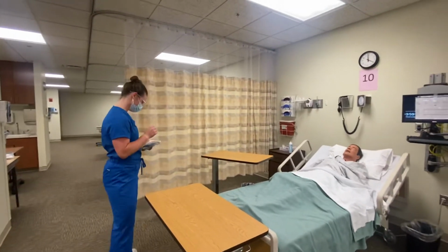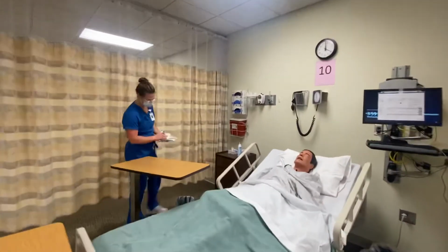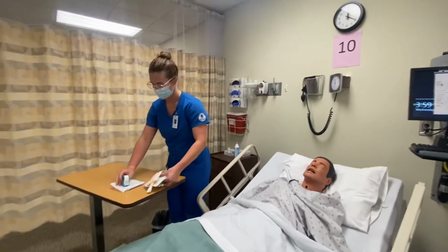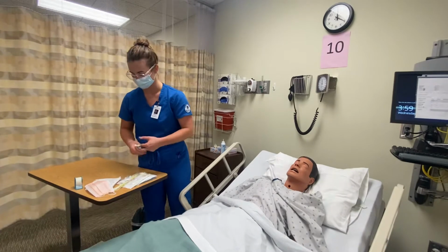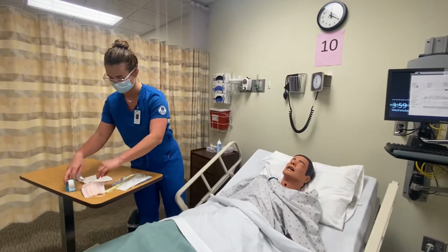Come in. Hi. Hi. My name's Liz. I'm going to be your nurse today. Hi. Just going to set some stuff up here. We're going to be doing a central line dressing change for you today, okay? Okay.